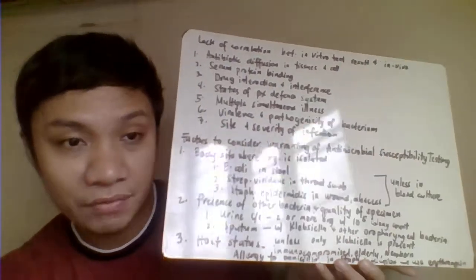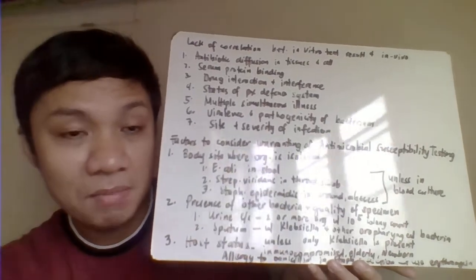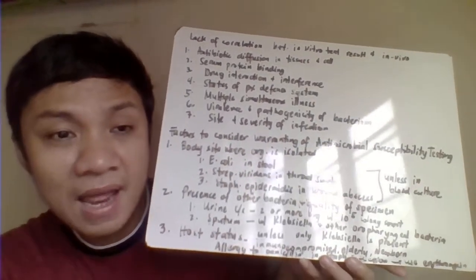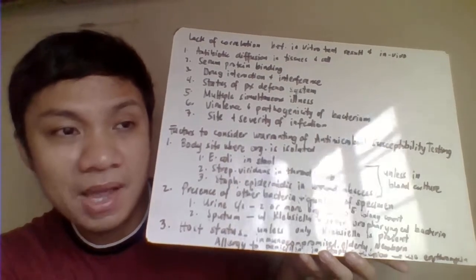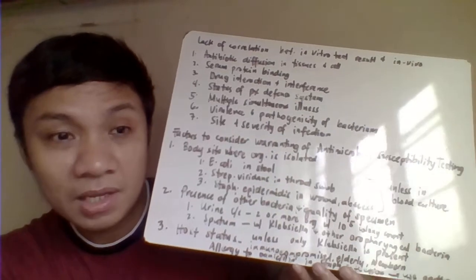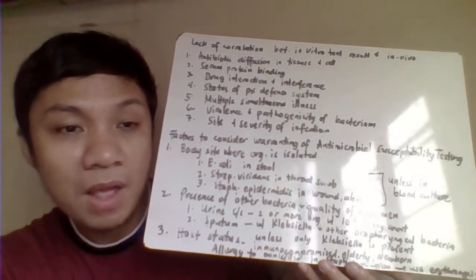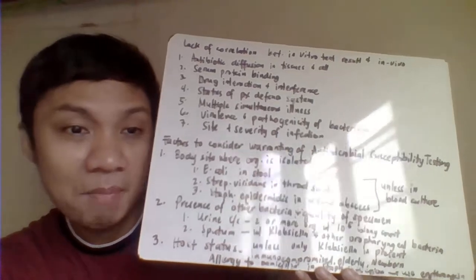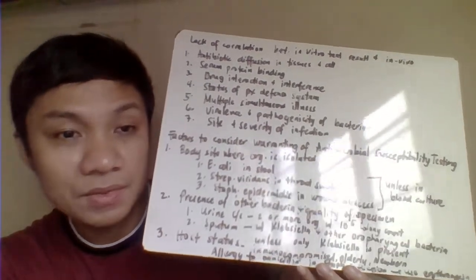Erythromycin, you can test for that. Pero normally kasi, erythromycin is not being given to your staph infection. Kaso nga lang, we are considering na may mali sa immune system ni patient. It might be because of that problem with the immune system, magiging iba ang result ng kanyang antimicrobial susceptibility testing.